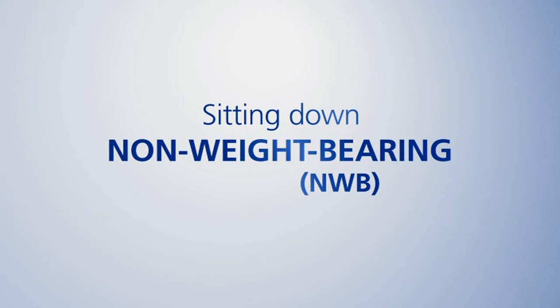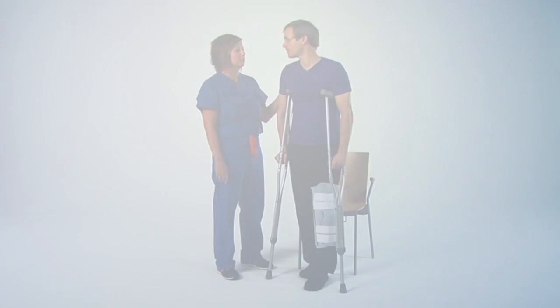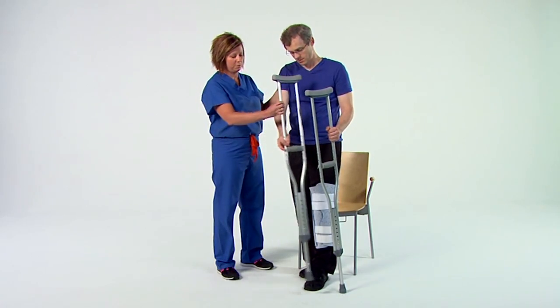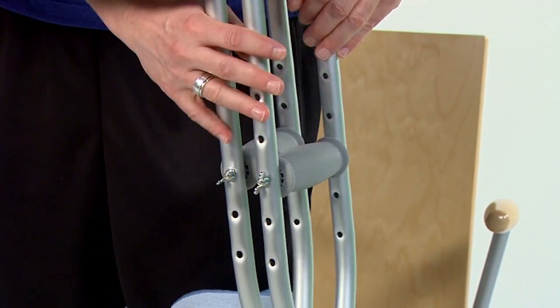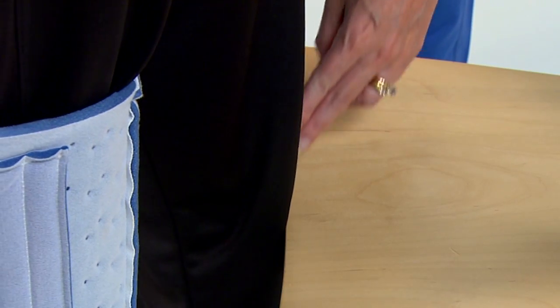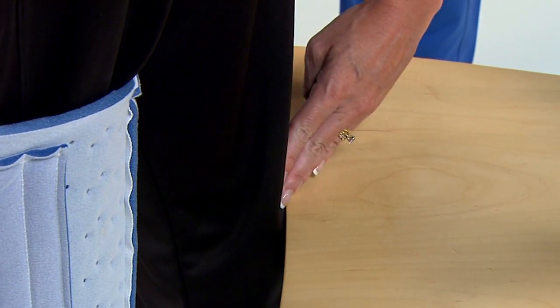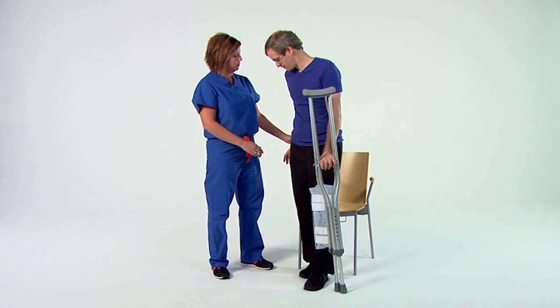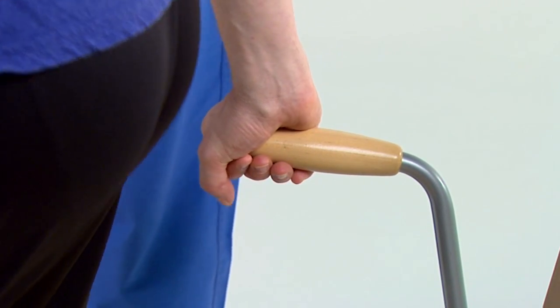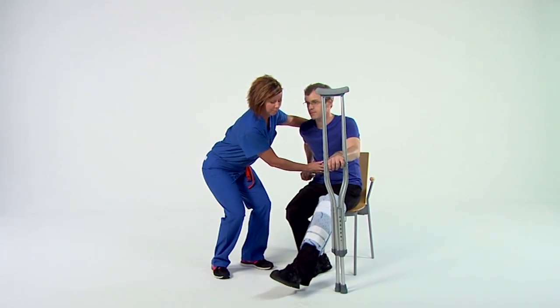Sitting down, non-weight-bearing. First, make sure there's a caregiver present and place both crutches on your surgical side. Next, make sure the back of your knee is against the seat of the chair. This ensures you can safely lower yourself onto the chair. Using your free hand, grab the arm of the chair and slowly lower yourself into a seated position.